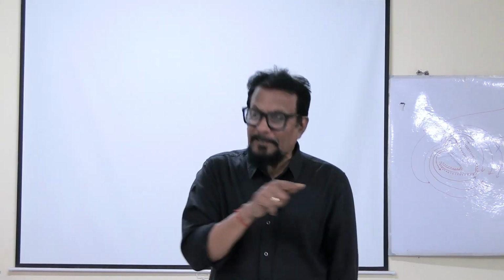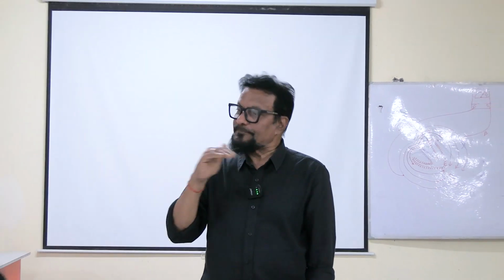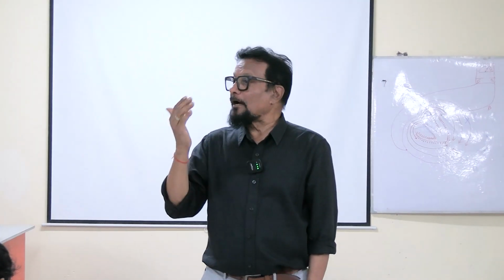Now, let us see. Whatever the leads are, they will produce some waves. These waves are PQRST. Some waves are positive, some are negative.